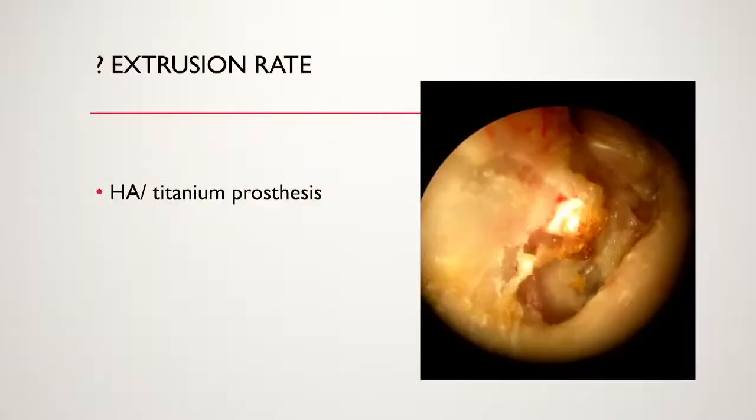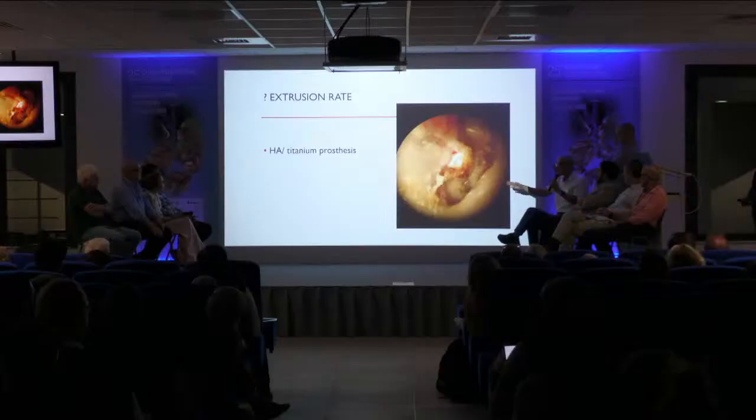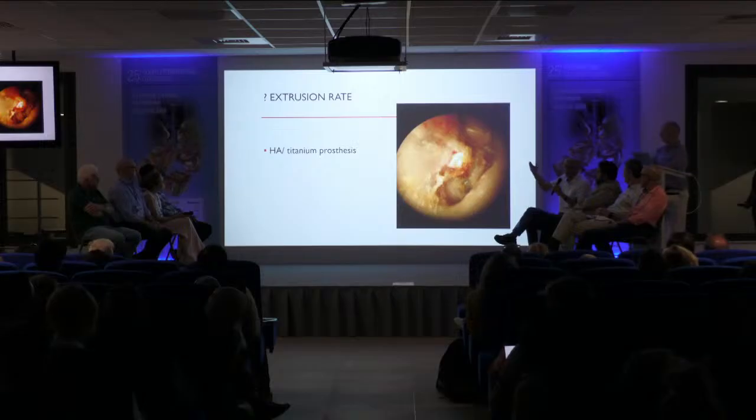Neil? The only comment I would make is I don't even really like this term extrusion rate, because it sort of assumes that it's the fault of the prosthesis. And really nowadays with biocompatibility, it's not the prosthesis that's the problem. It's the disease that's the problem. Oh, no, for sure. Absolutely. It's not an extrusion rate based on what you're using.